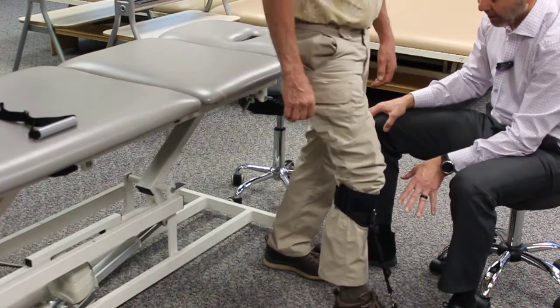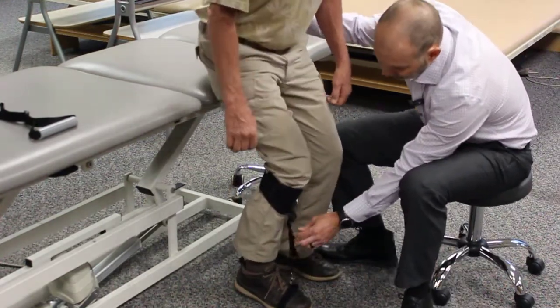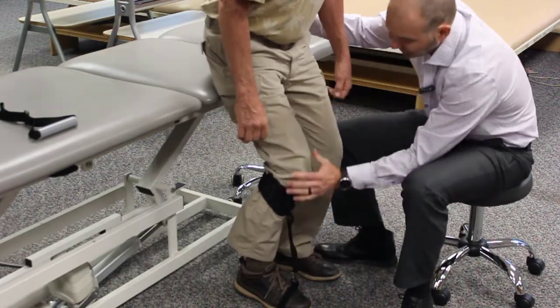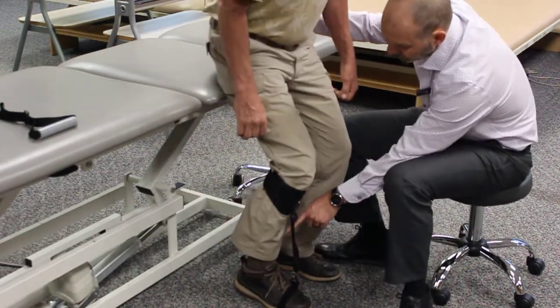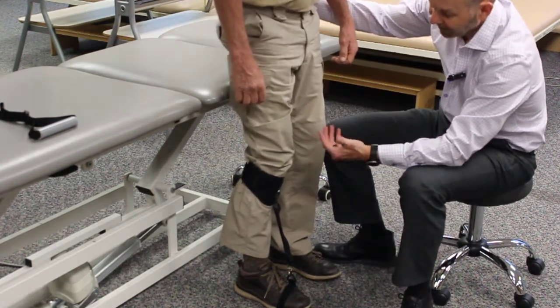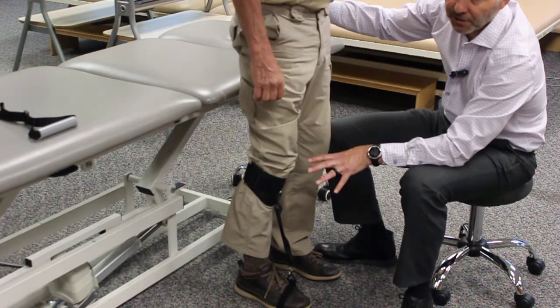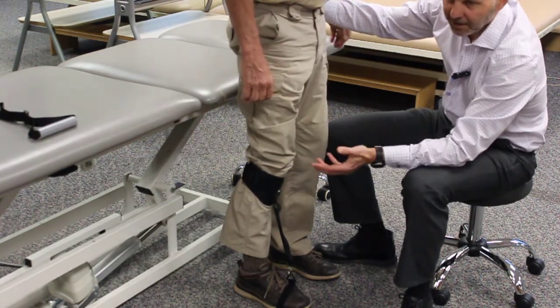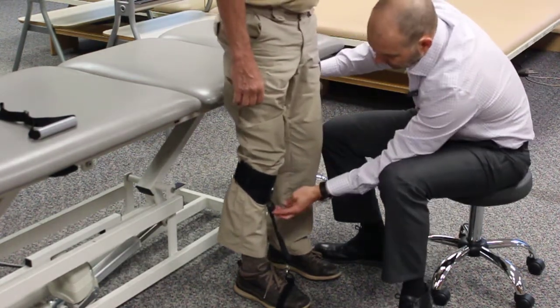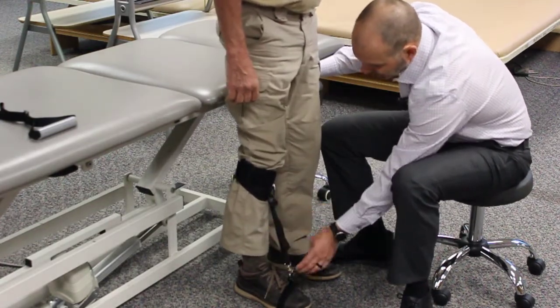Depending on how tight we make this, so Steve, just do a slight little squat for me. And if I take up some slack here, and now if we were doing some partial squats, that's going to restrict his knee extension at the top end there, so it can act like a dynamic restraint to prevent knee hyperextension during simple exercises like sit to stands or partial squats. And I'm just going to loosen that up a little bit to give you a little more motion there, and then retighten that just a little bit.